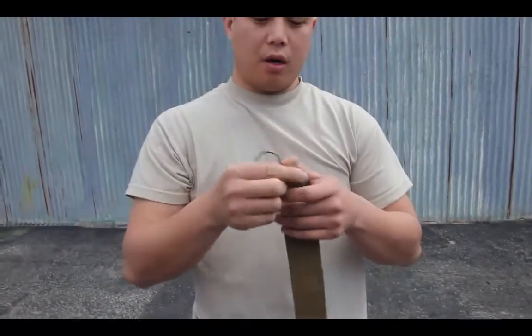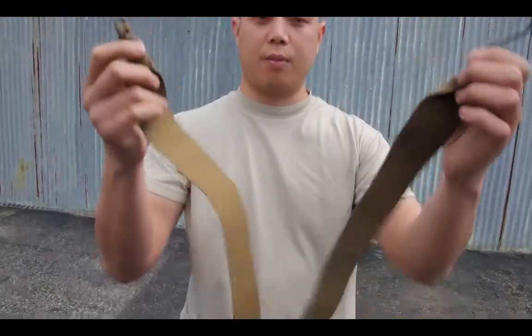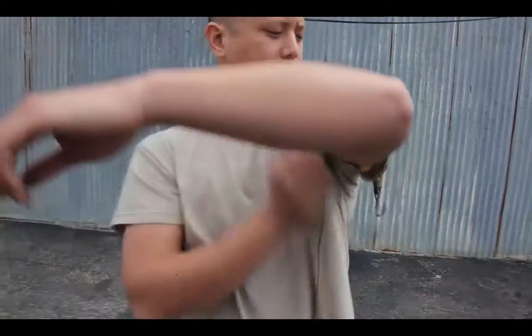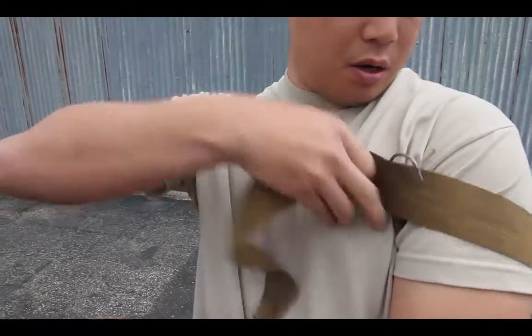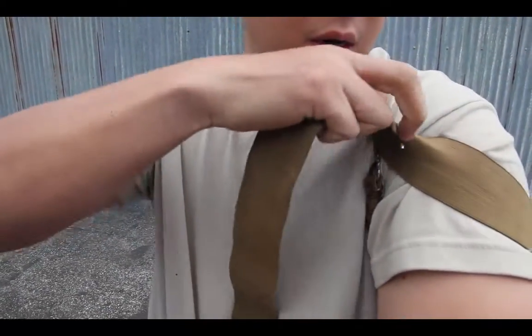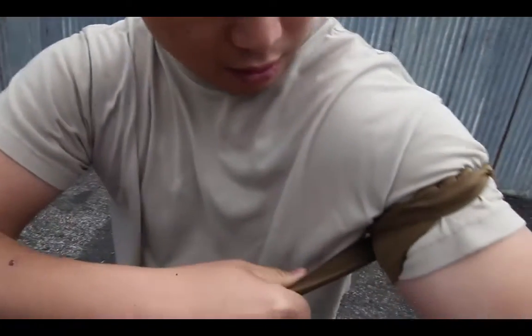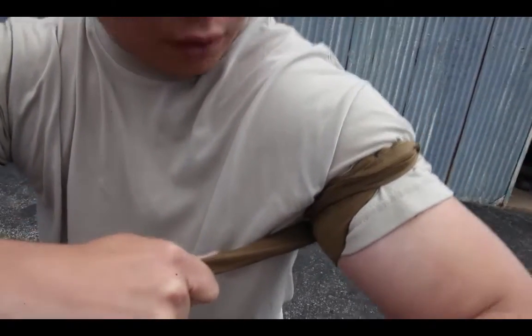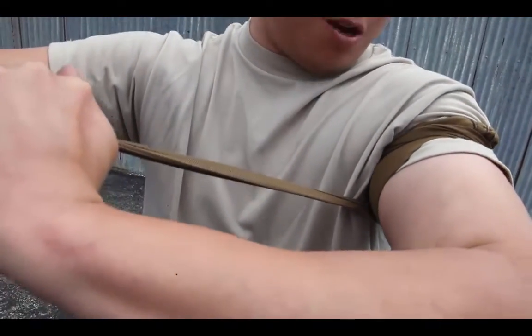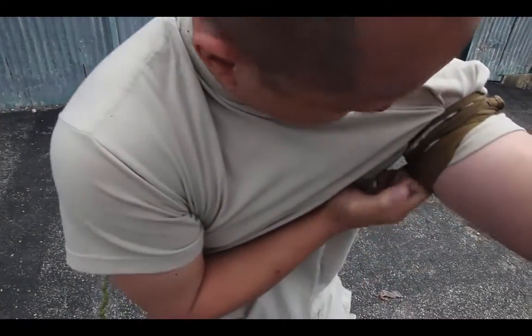I'm going to demonstrate on a TK-4 tourniquet. Pretty straightforward — you've got two basic hooks right here, same on both ends, it's symmetrical. Put that high up on here, snake one side into the tourniquet, get it started and then pull. After at least the first or second wrap, pull all the slack out of it like you're pull-starting a lawnmower, and keep pulling all the slack out every time you wrap around.